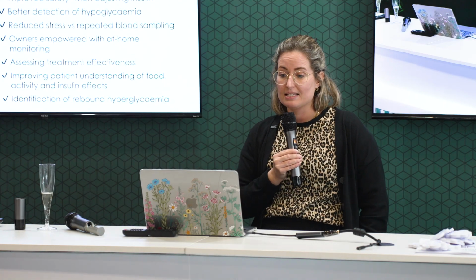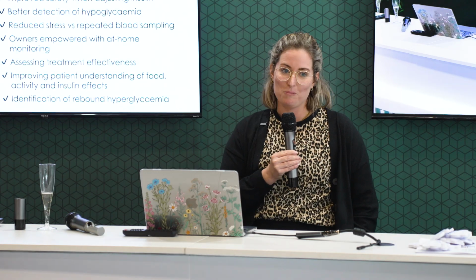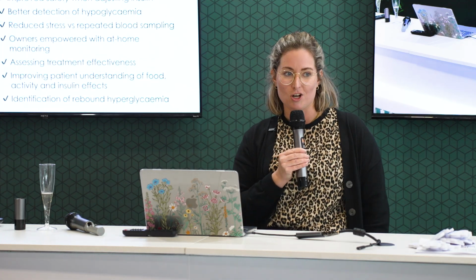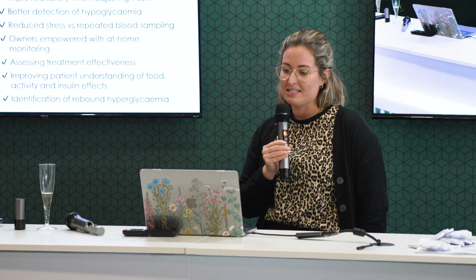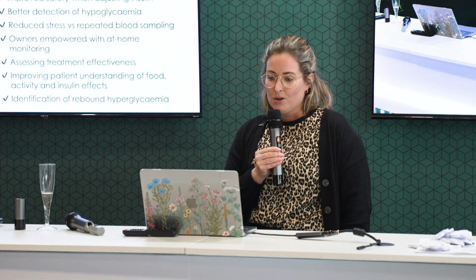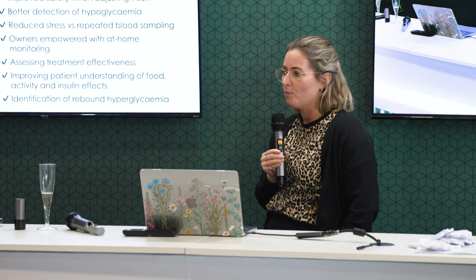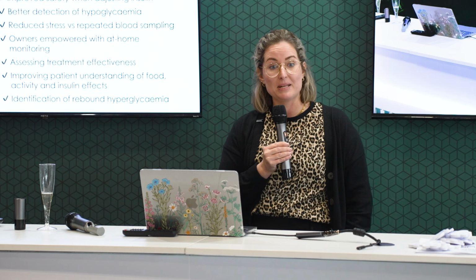It's going to reduce stress and repeated blood sampling. So for me, that's going to make my day if I'm working with you as a vet and you say, actually, do you know what, we'll put one of these on, because it means I'm not going to have to stick a needle in my patient every hour or two. It's going to help owners to feel empowered with at-home monitoring as well and get them on board with helping them to understand diabetes and understand diabetes in their pet.